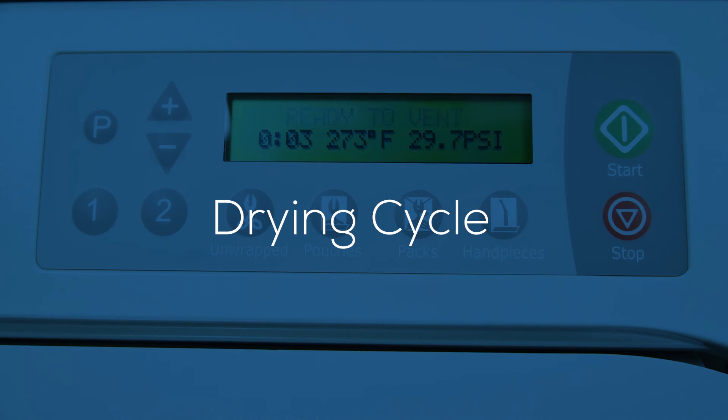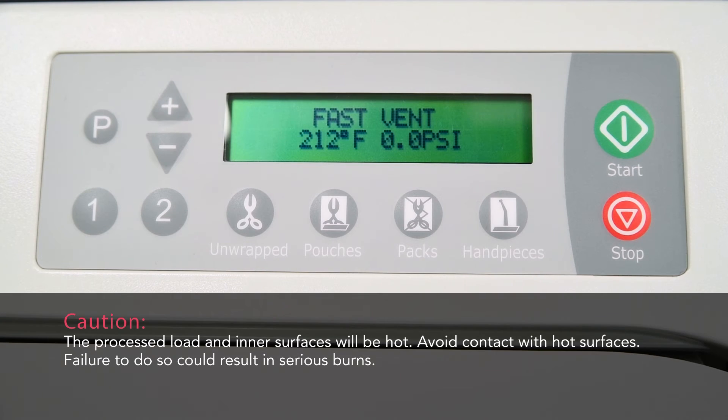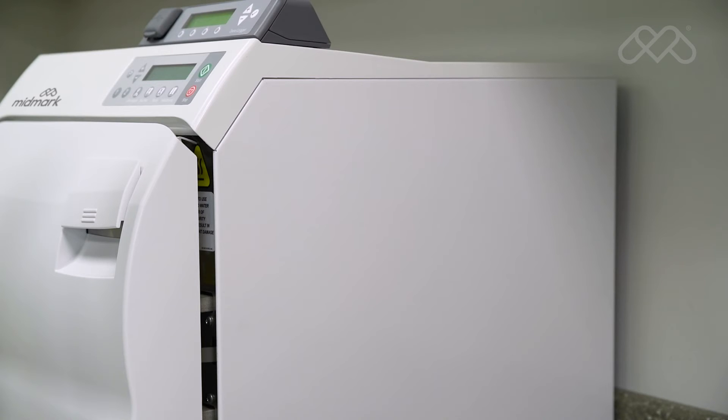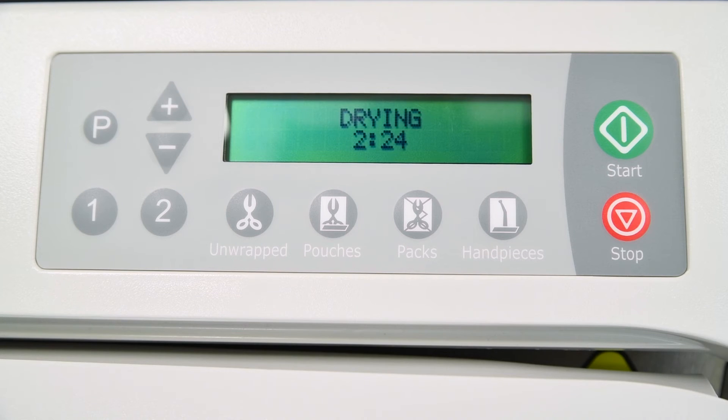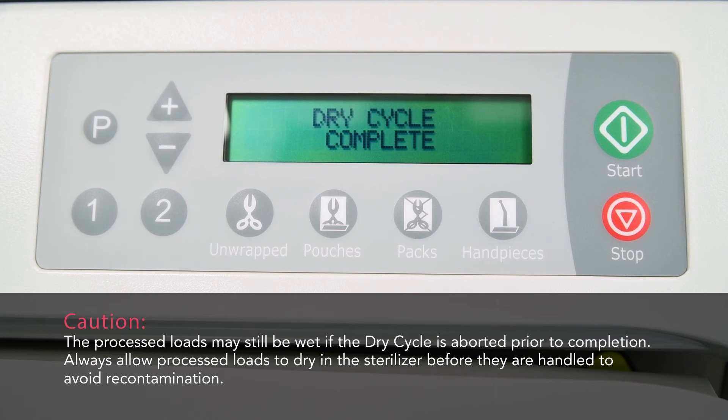While the sterilization cycle finishes, the display will change as temperature and pressure in the chamber changes. An audible signal is emitted to indicate that the door is about to open. When the pressure in the chamber reaches zero, the door will partially open, beginning the drying cycle. The sterilizer will now display the amount of time remaining for the drying cycle and will count down to zero. At the end of this countdown, an audible signal is emitted for 10 seconds, indicating that the sterilization cycle is complete.